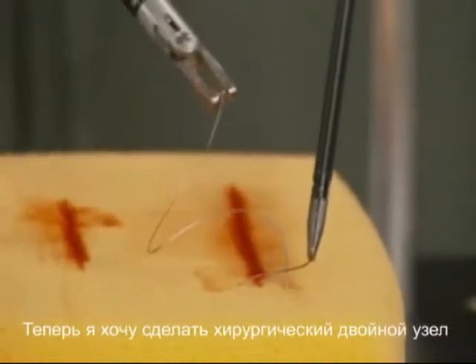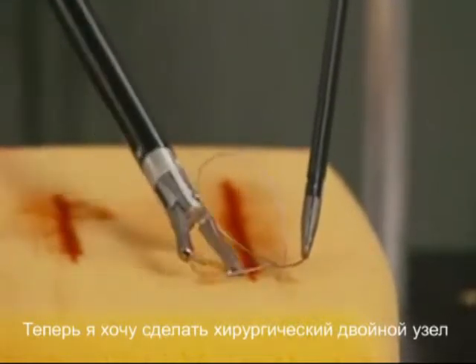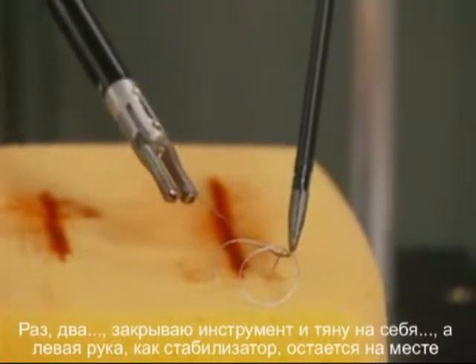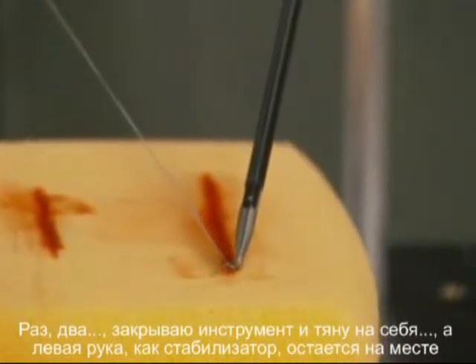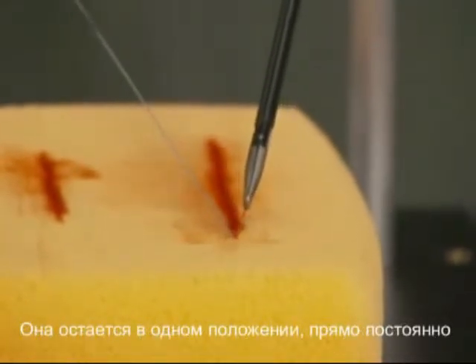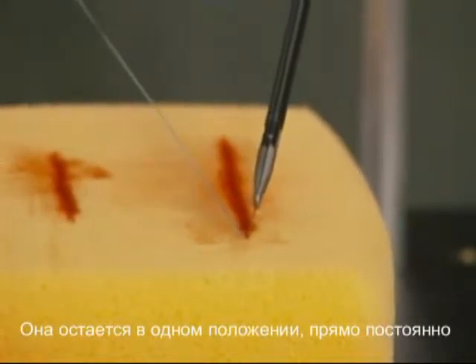Now I'm going to make a surgeon's knot here and a couple of throws. Always close the instrument when you pull back. Notice how my left hand, which is like the anchoring hand — we call this the post — doesn't move much at all. I'm going to keep that straight the whole time, straight up.